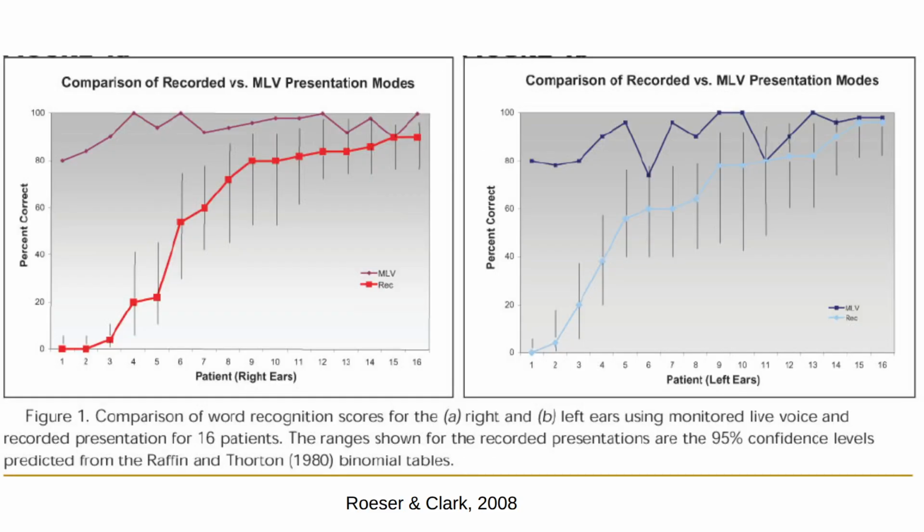Here's an example of something I want to show you regarding comparison of recorded versus monitored live voice speech. You can look at either the right ear or the left ear. It shows the same data from 16 patients.